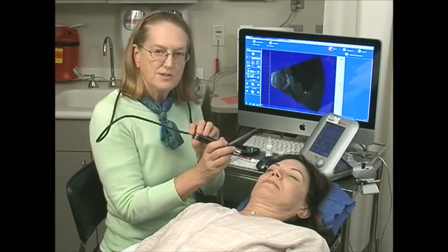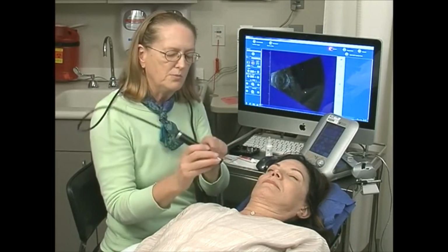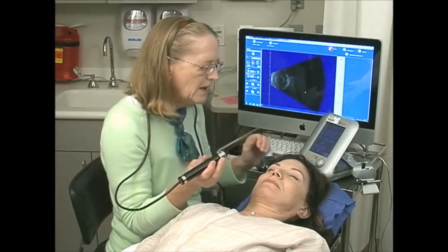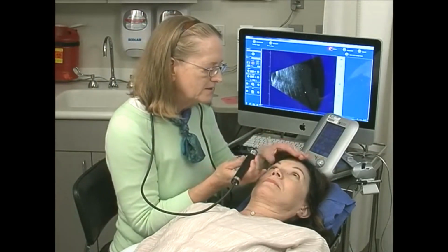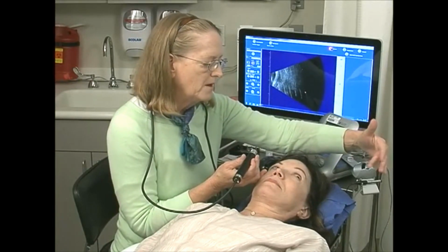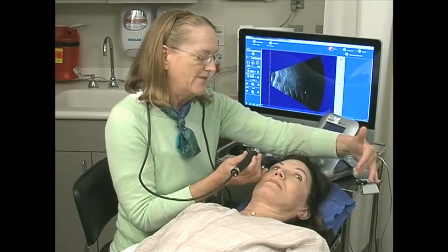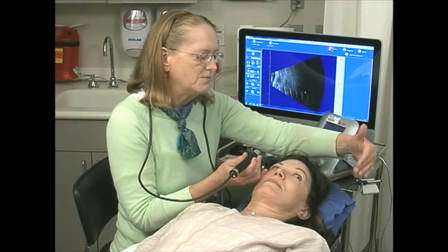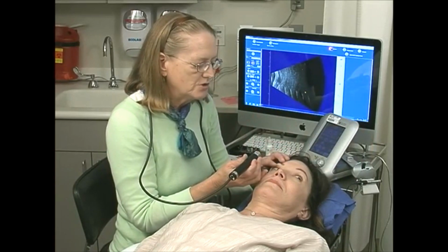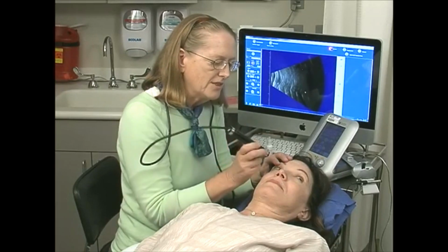We'll do exactly the same 2 scans for transverse for vertical. Now the marker will be placed superiorly. I'll add a little more gel. Now I'm going to have you open your eyes and I'll have you look to the left. A little higher, see my finger right here. Most patients don't look where you want them to look when their eyes are open, and they certainly have a hard time when the eyes are closed. So that's why the majority of ultrasounds are performed on the sclera, unless there's a case of recent surgery, trauma, etc. So now you can see she's looking to the left, she's looking at 3 o'clock.